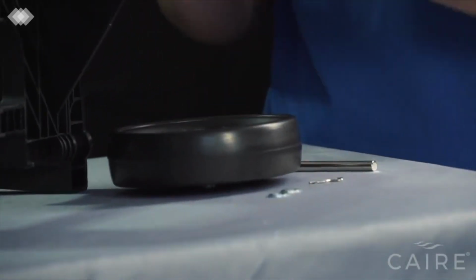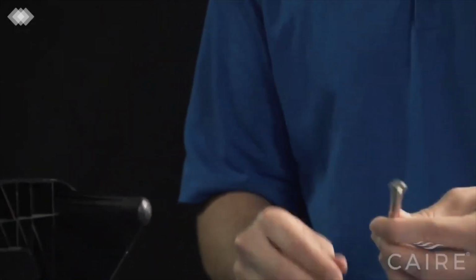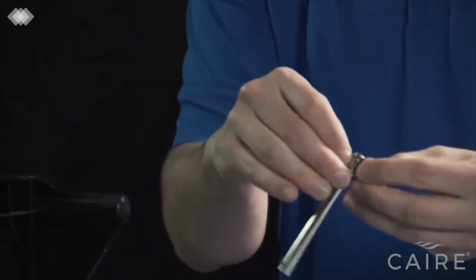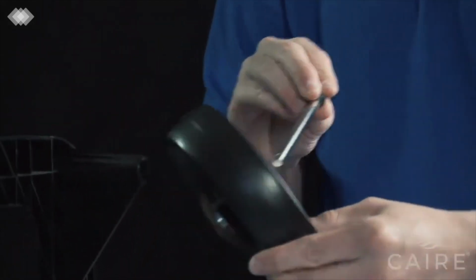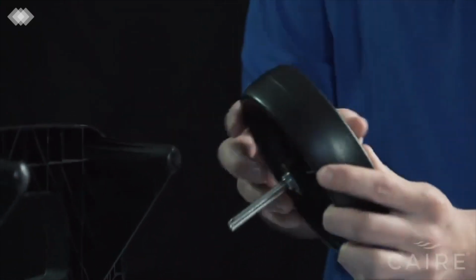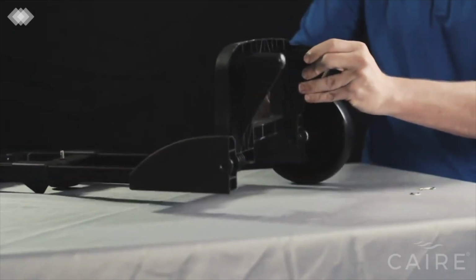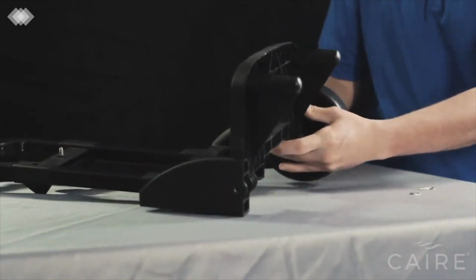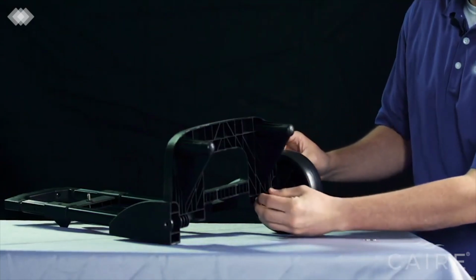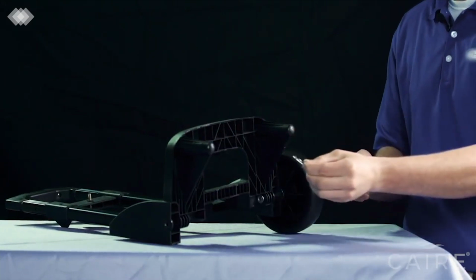So you'll need to install each wheel onto the cart. First things first, you'll want to put the axle through the wheel. Install a washer onto the side that has a built-in washer, and then slide it through from the smooth end of the wheel, like so. Then you'll want to push it into the cart. At this point, once it's locked in place, install the second washer on the back end, and then install the C-clip to secure the wheel.